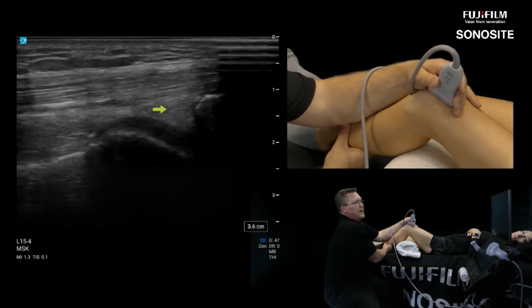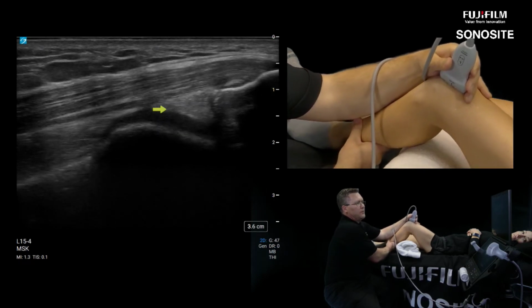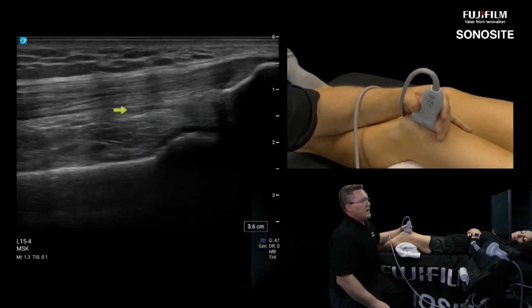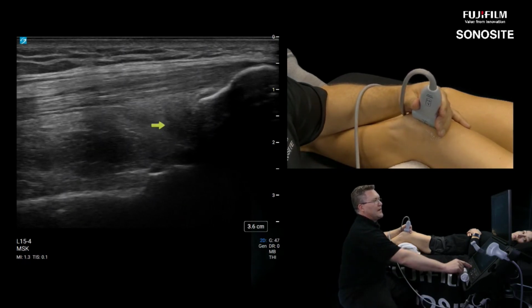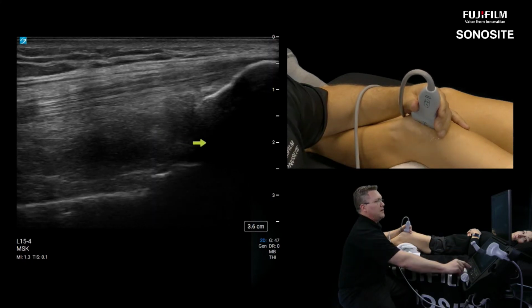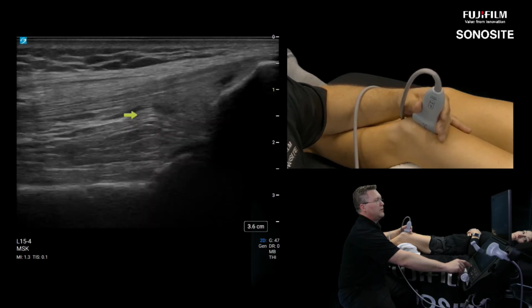And then I always find that slightly more lateral of midline, I catch just a bit more of the suprapatellar recess than if I were to hang the transducer over medially. Okay, so dynamically, that's one way to tell where the suprapatellar recess is in a dry knee. Another way is to have the patient actually tighten their quad. And you can see that same recess, and oftentimes this tensioning here of the quad tendon will pull up and cause kind of a syringe-like vacuum and actually pull some of the fluid into the suprapatellar pouch. So we don't see that here today. Normal healthy knee, I think we saw that in the cartilage exam.